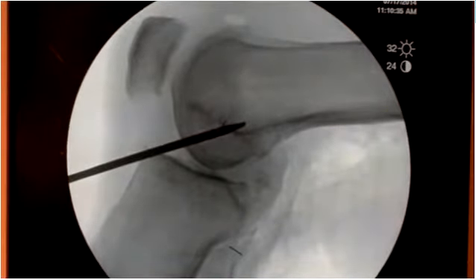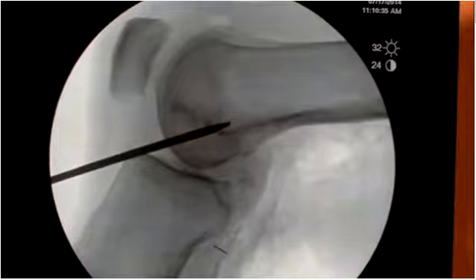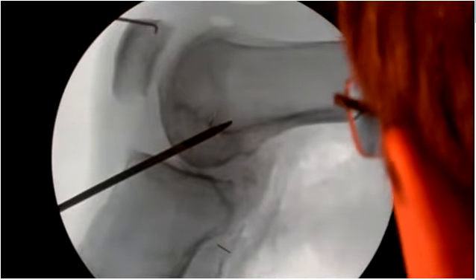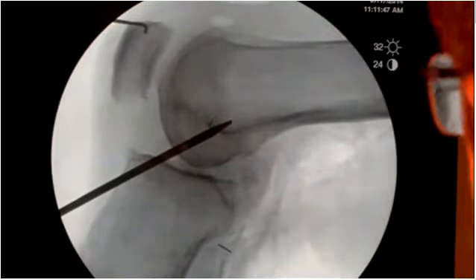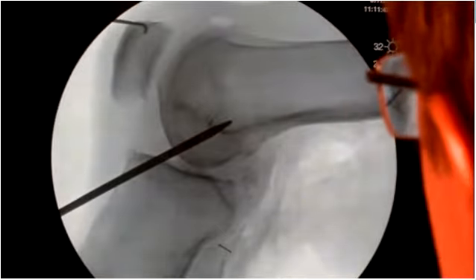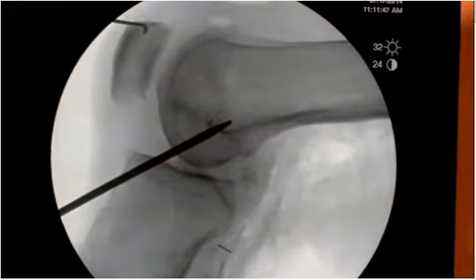And you can show also the patella position, Roman. Yep. So we can take another fluoroscopic image. So there's the patella. So usually it's on the upper third of the patella, fluoro again. Yeah, so that's where I would put my upper tunnel, and the other one centimeter more distal from this point. Okay. Now superficial MCL. You can show that.